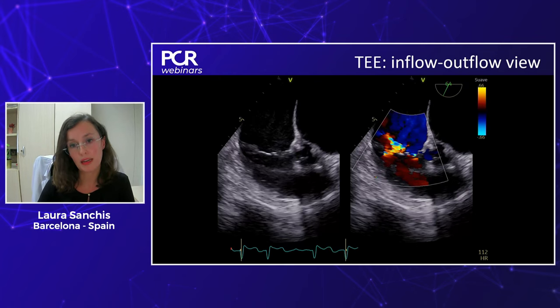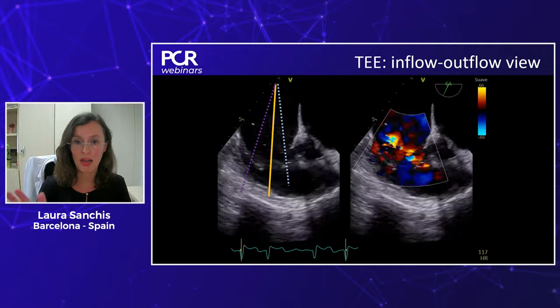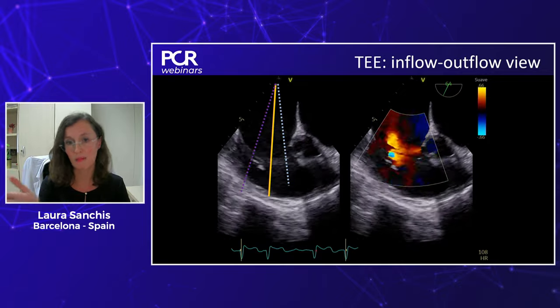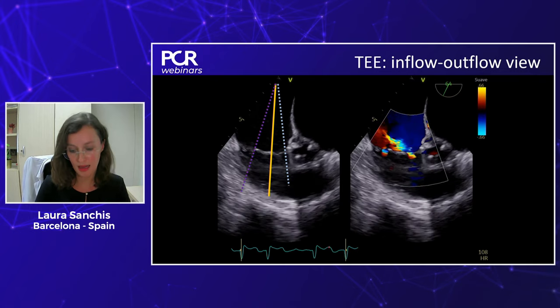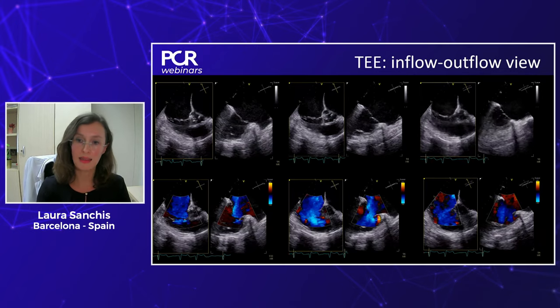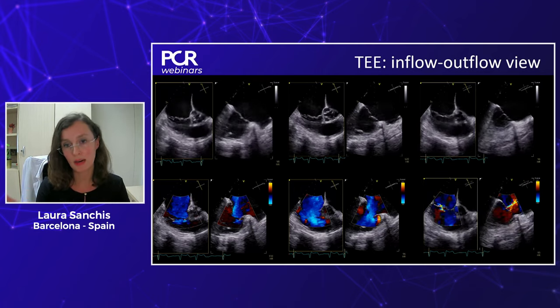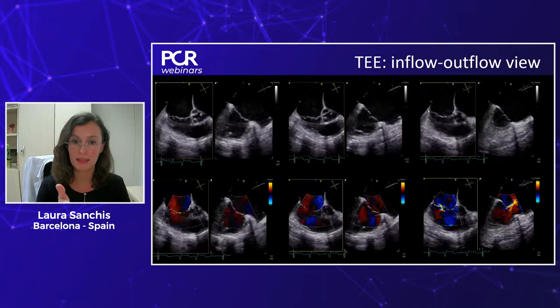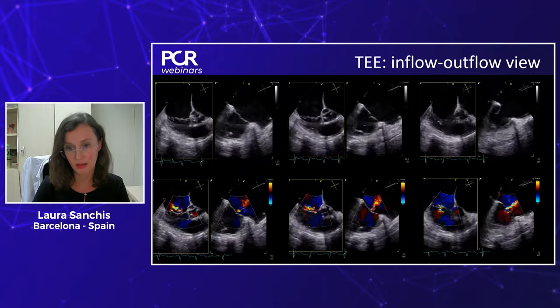The two most important views for the tricuspid valve are: first, the inflow-outflow view, where we have the aortic valve on the right and then the free wall, giving us the antero-anteroseptal and posteroseptal sides of the valve. If we put the biplane line over this valve, we can screen all parts of it — confirming coaptation along the anterior, middle, and posterior parts. This is important to know the coaptation gap, which we will discuss in detail.